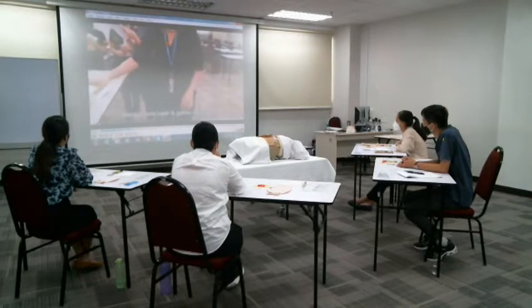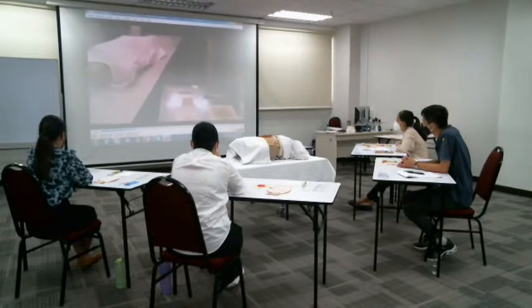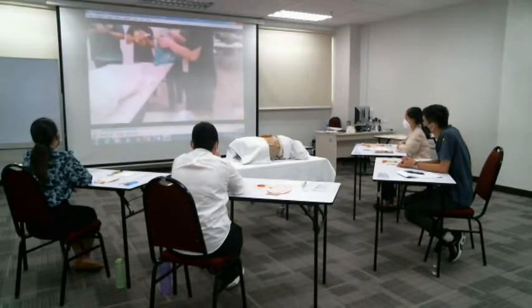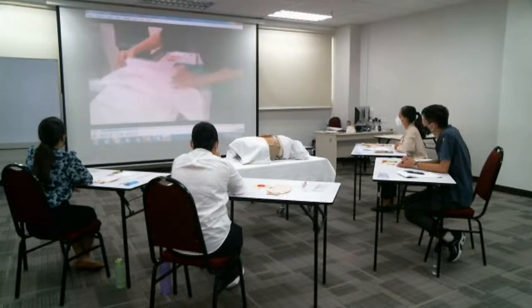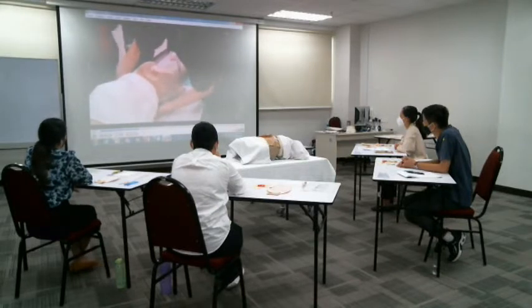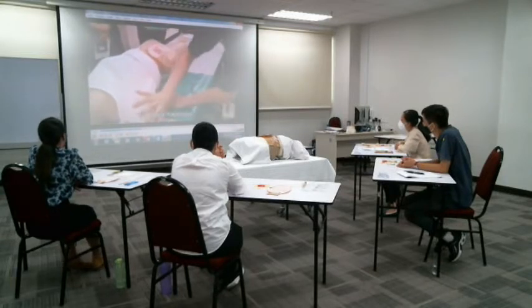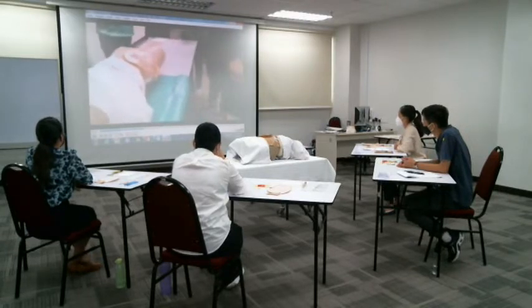Put everything together so that it will be more organized. Then position the patient. If the bag is dirty, then you have to change it. Make it in a way that it is near us, so you are able to handle it properly. Keep the pouch below. Then you take out your receiver.